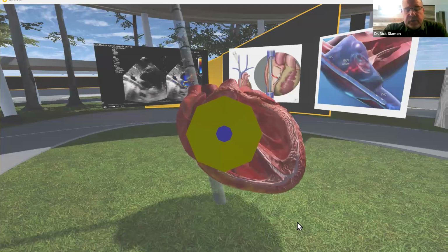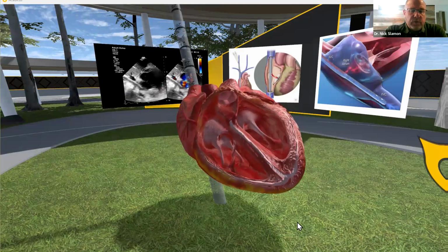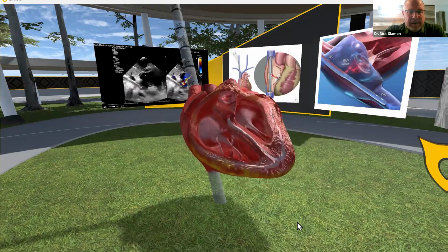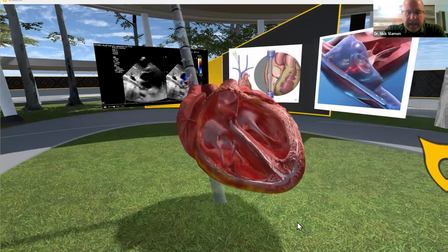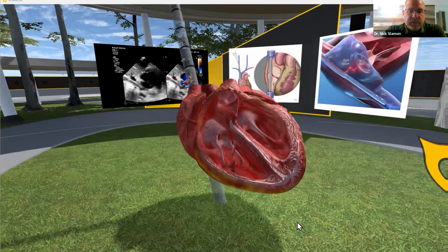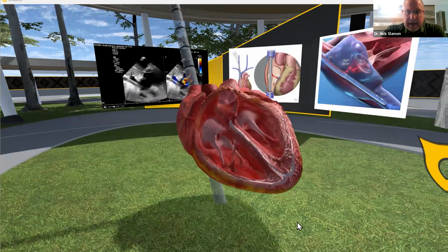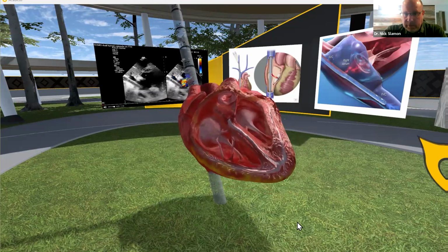So speaking of features that we took advantage of, this is that mini module that I just described, where how do you know where to put the cannula? How deep should the cannula be? Where should it be placed? And as Dr. Kalbach said, there's some infusion port that directs that oxygenated blood across the tricuspid valve.